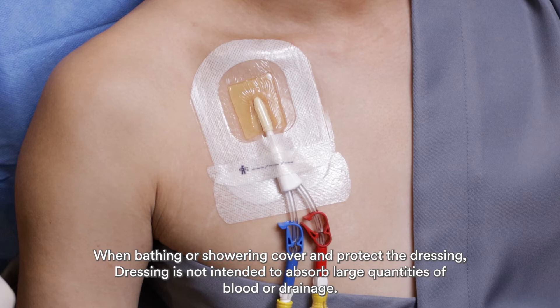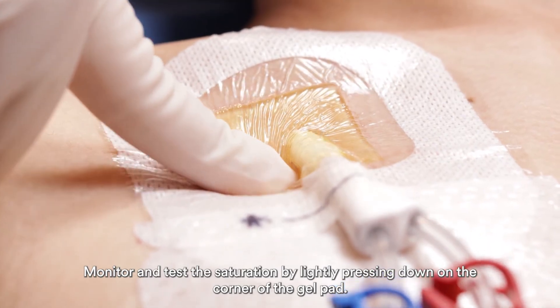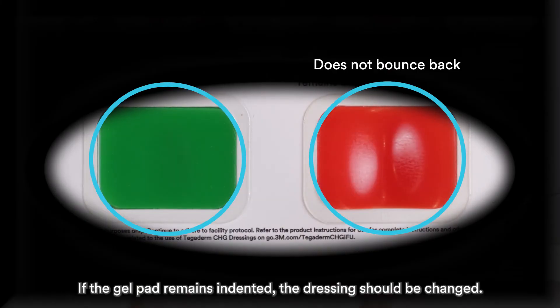When bathing or showering, cover and protect the dressing. The dressing is not intended to absorb large quantities of blood or drainage. Monitor and test the saturation by lightly pressing down on the corner of the gel pad. If the gel pad remains indented, the dressing should be changed.